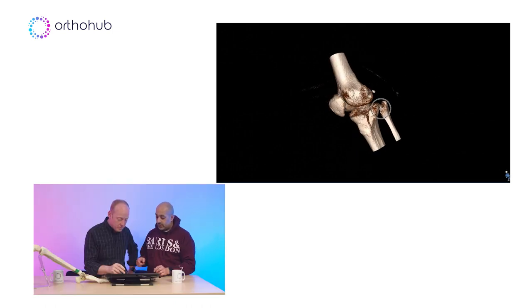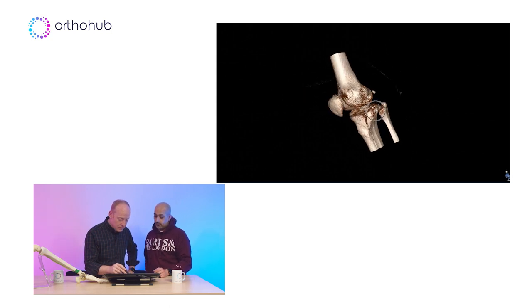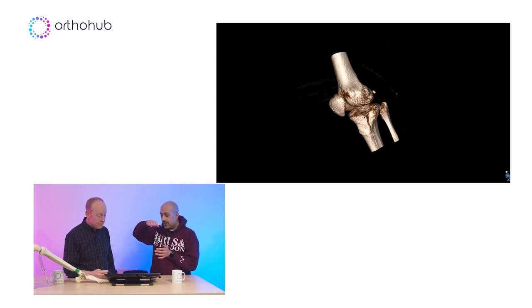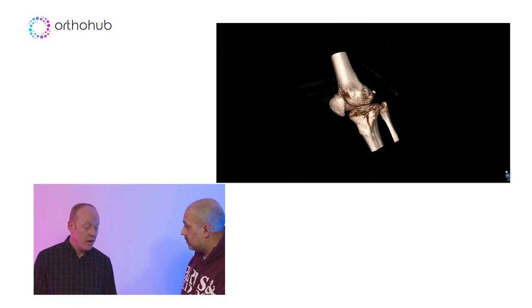So the key here is you can see where your access point is. There's your front door. Draw us the front door, Pete. Front door. Boom, right there. And you can just open that up, get something in there, elevate your surface, and then put some rough K-wires in, fix it in place, and then go from there.